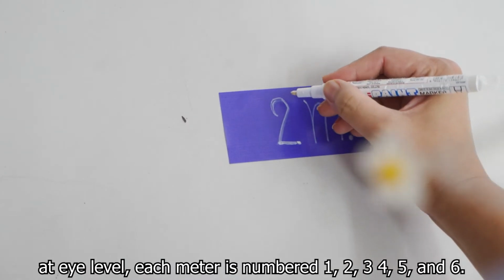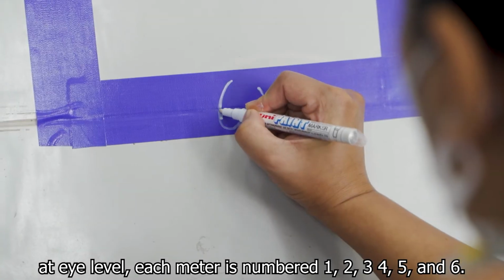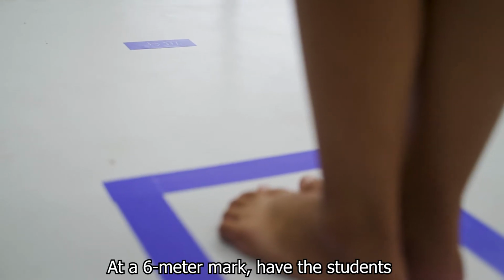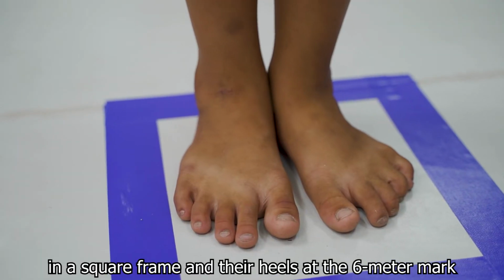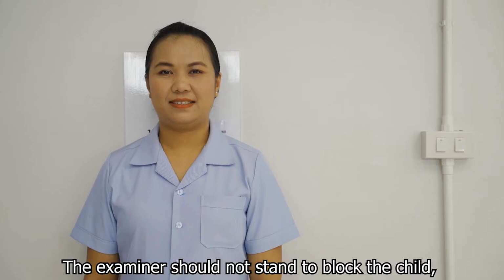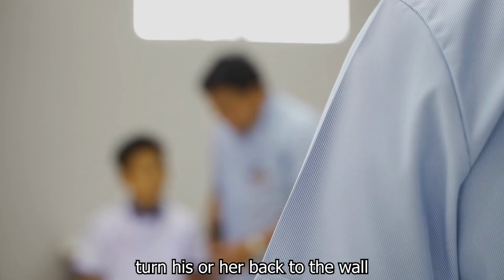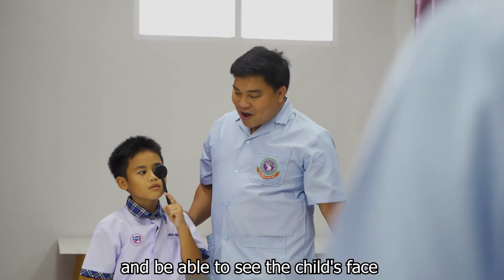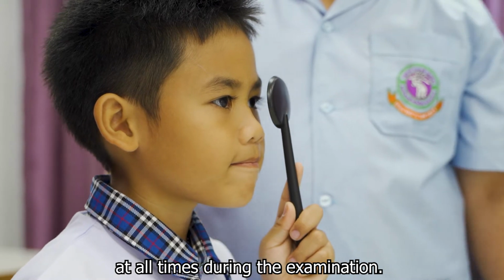Each meter is numbered 1, 2, 3, 4, 5, and 6. At the 6-meter mark, have the students stand with their feet placed in a square frame and their heels at the 6-meter mark. The examiner should not stand to block the child, should turn his or her back to the wall, and be able to see the child's face at all times during the examination.